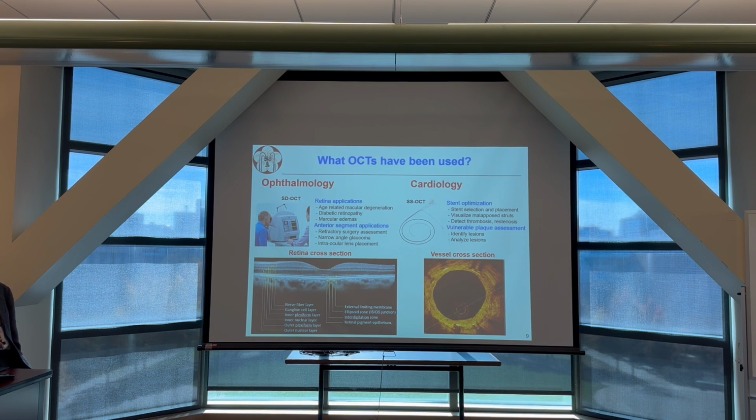These days people even try to use longer wavelengths, so you can penetrate deeper than the retina to the choroid layer, where there are blood vessels. So a lot of companies are working on ophthalmology.